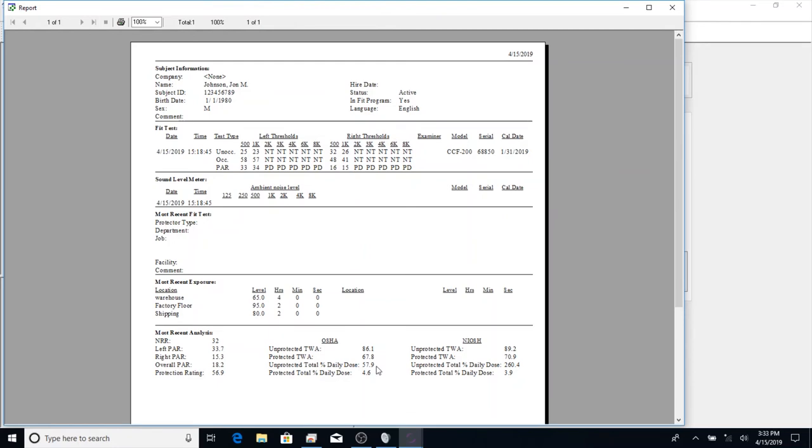This worker, according to OSHA, when he's unprotected, he is still in safe levels. And when he's protected, he's only getting 4% of his daily dose.